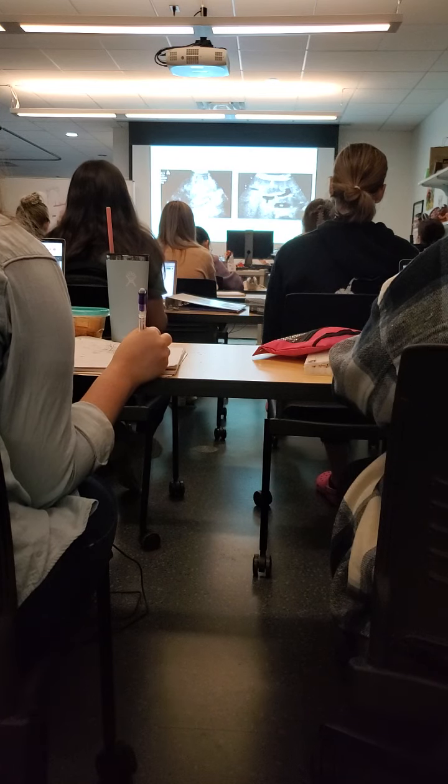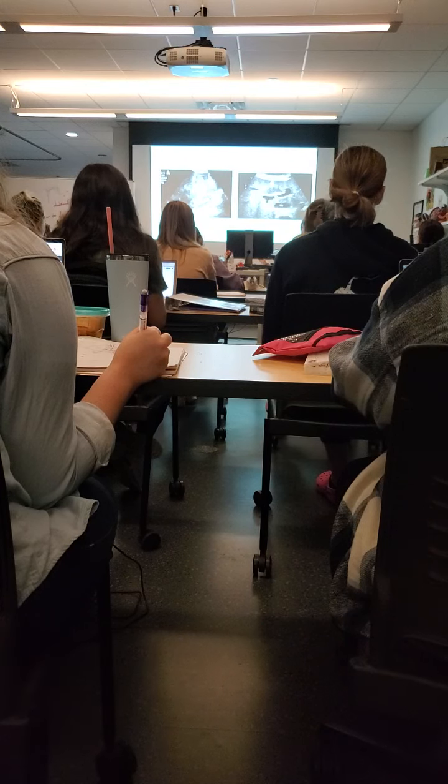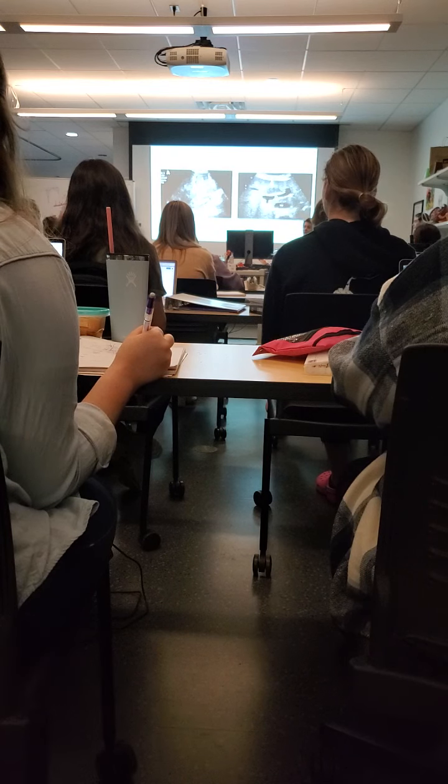This, by the way, is close to that portal vein. What sits next to the portal vein? Pancreas, gallbladder. This is mainly where you're going to see, when somebody has a fatty liver, sometimes the liver will compensate and be like, okay, all of you can be fatty, but this one area. And so this is the fatty infiltration. It's basically giving you a sign that, look, this is a fatty liver, and we've got some fat hanging out, because that's usually where it starts.